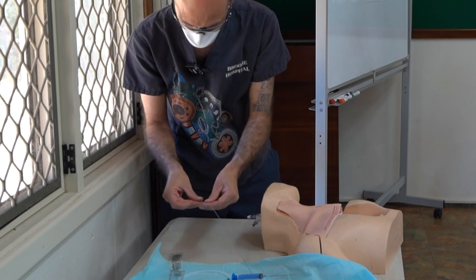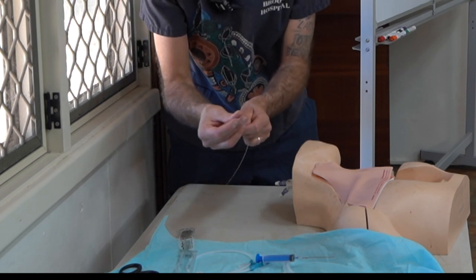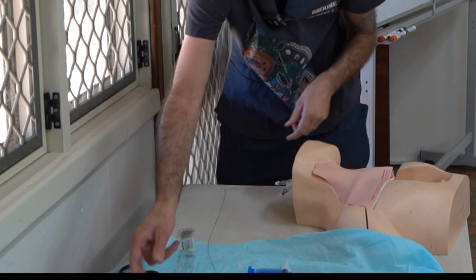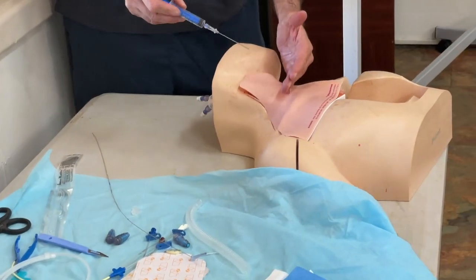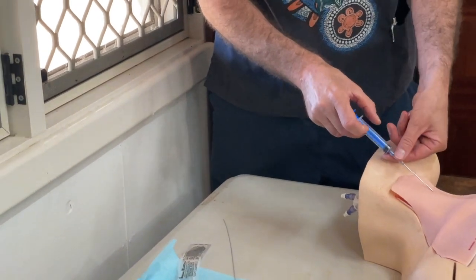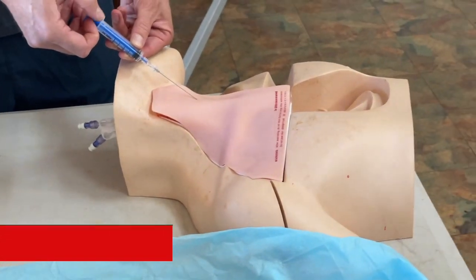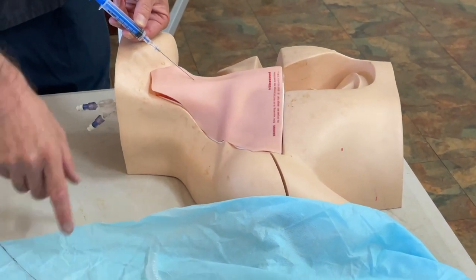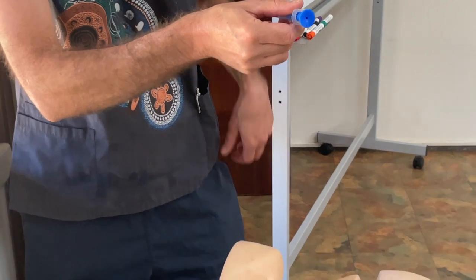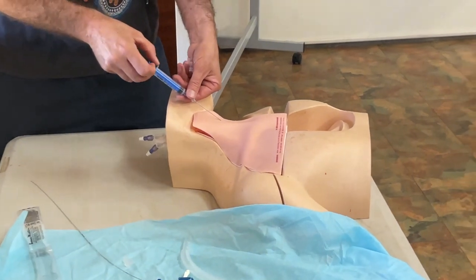Once I've done that, I'm going to assume I've got my ultrasound on. Ultrasound's in cross-section. I'm going to do a straight needle — you can do this with a cannula, but I'll show you this way first. What I've got is my ultrasound, and I've gone in through the skin through the anesthetized skin. I know where the spot is, and what I'm now doing is pulling back on the plunger. This syringe comes in the pack — it's got a little hole in the back where your wire's going to go down. So I go in through the skin with ultrasound on, and I can see my needle on the screen.